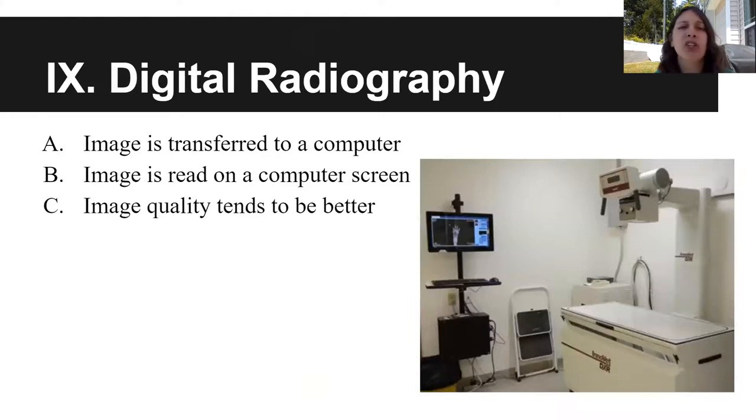Then our third option is digital radiography. And this one, I can't even imagine how expensive this is. Because with digital radiography, essentially as soon as the X-ray is taken, it jumps right over to this computer. No processing, no exposure. It just pops up clear as day, typically in a better quality, for the vet to be able to see and interpret.